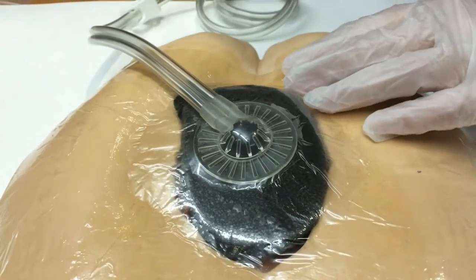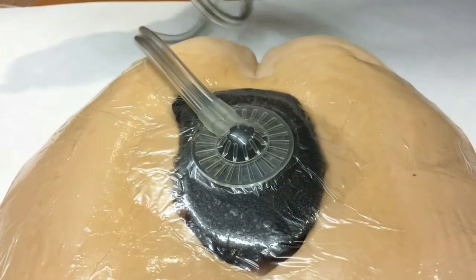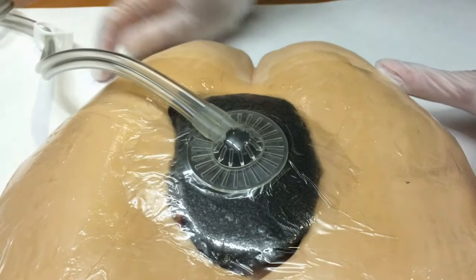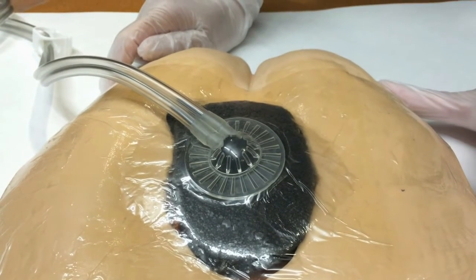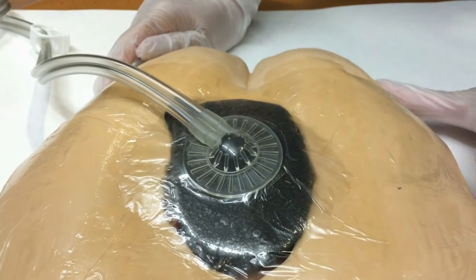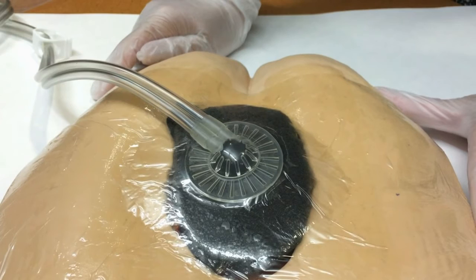Now we're just going to take our tubing, connect it to our canister and our pump, and we're going to turn it on. We're going to check that the doctor's orders — what he actually ordered for millimeters of mercury — just to double check. Turn it on, and you're going to be good to go.